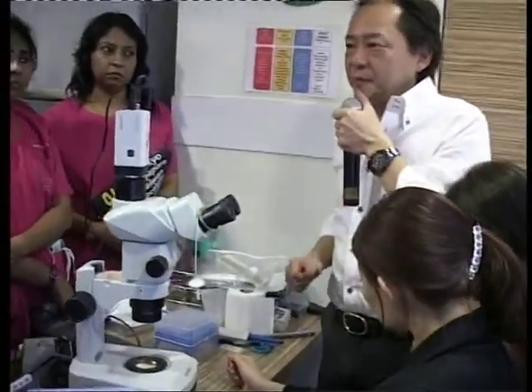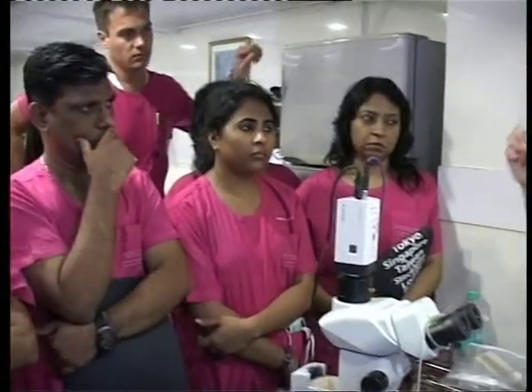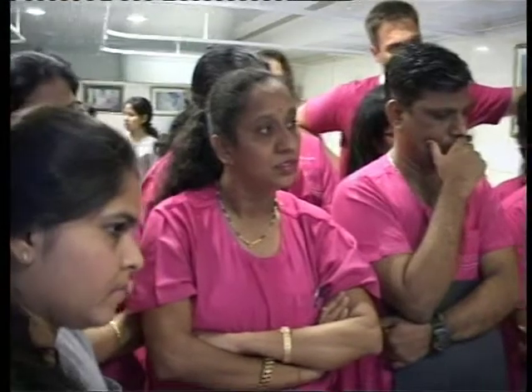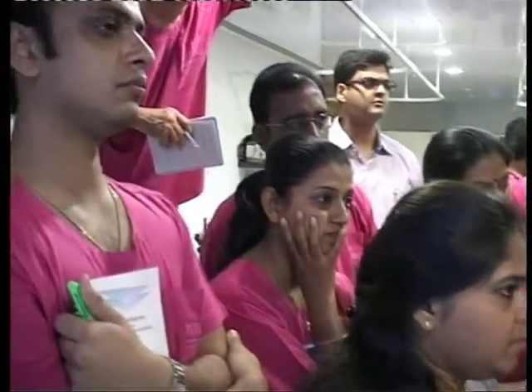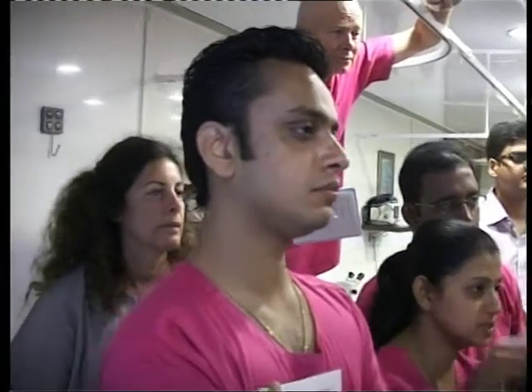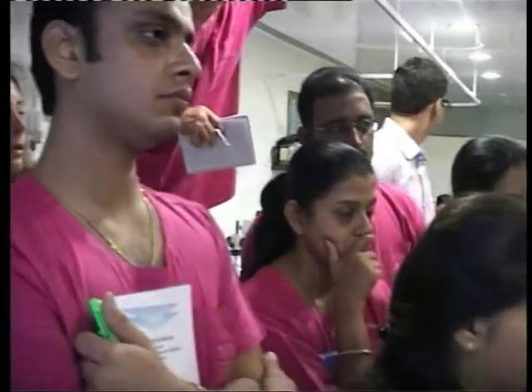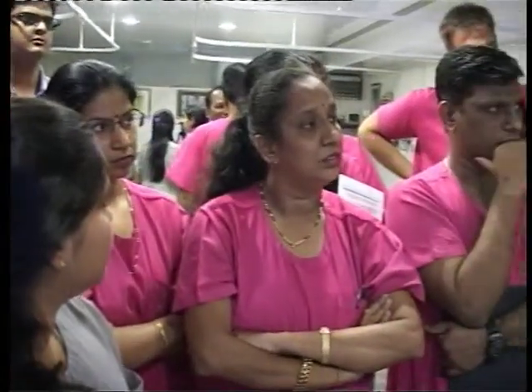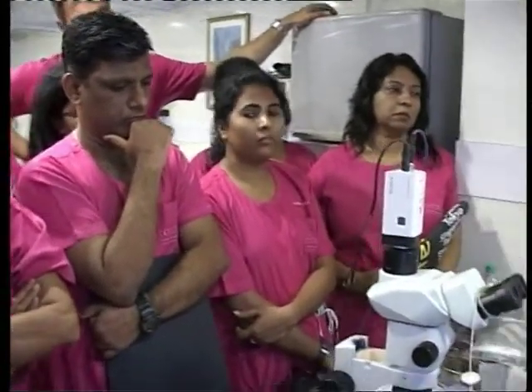Yes. If you want to vitrify nine oocytes, you put nine oocytes in the equilibration solution. Then you wait. If you find three recovered, you take three and move to vitrification. Then when you find another three recovered, you go to vitrification with the same solution. You can repeat three times with the same solution.